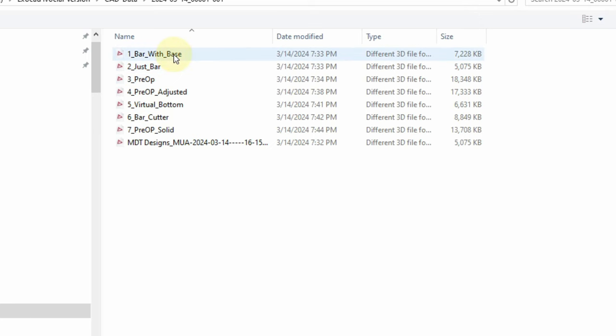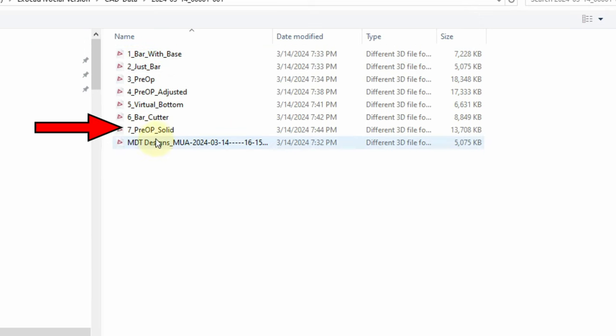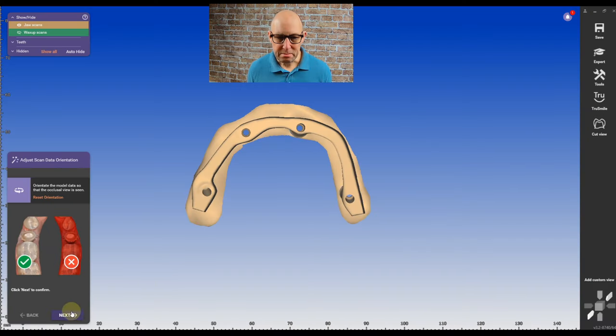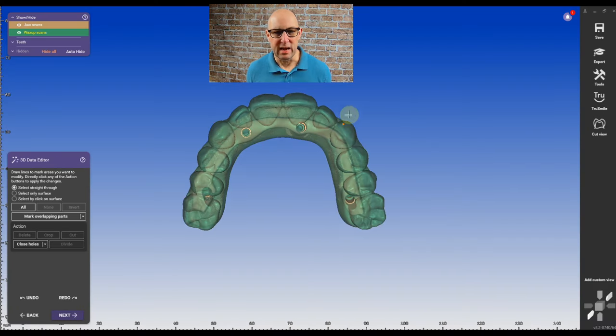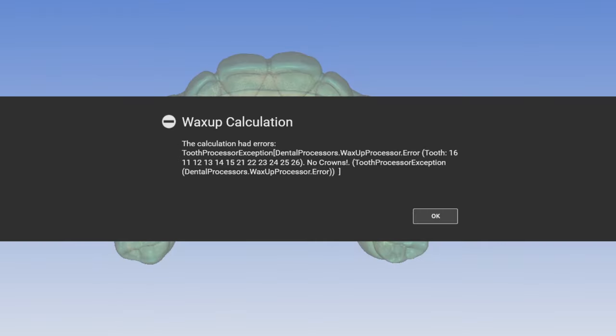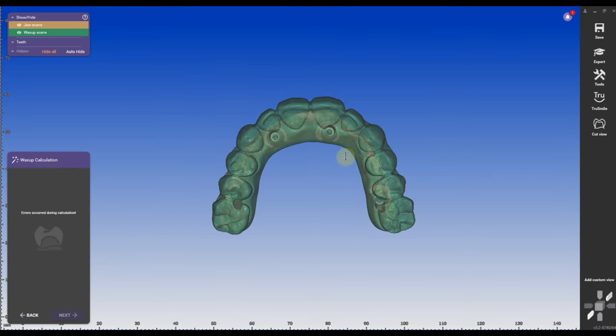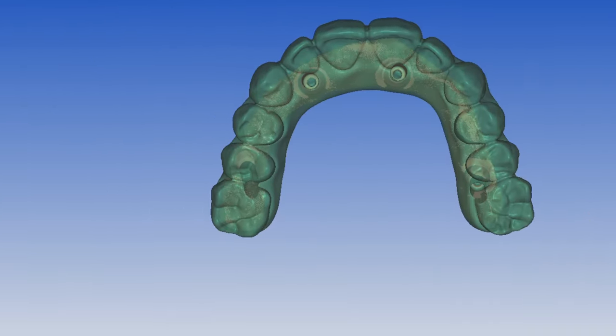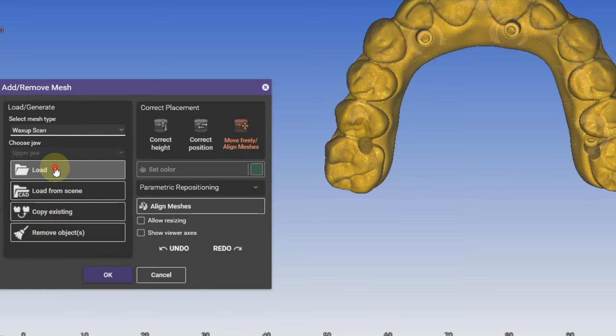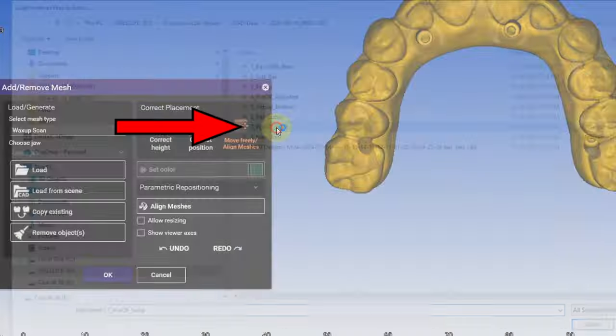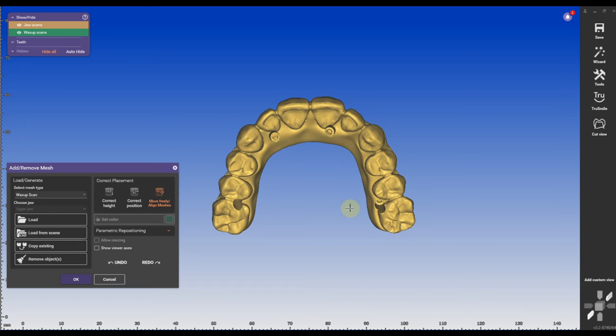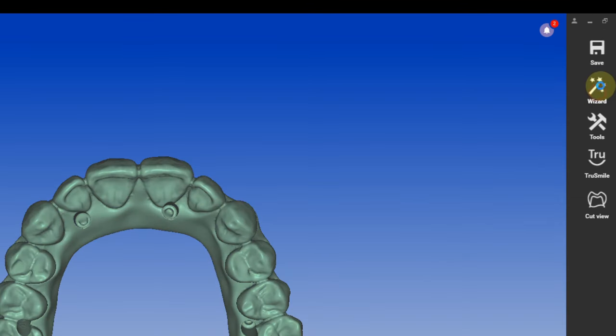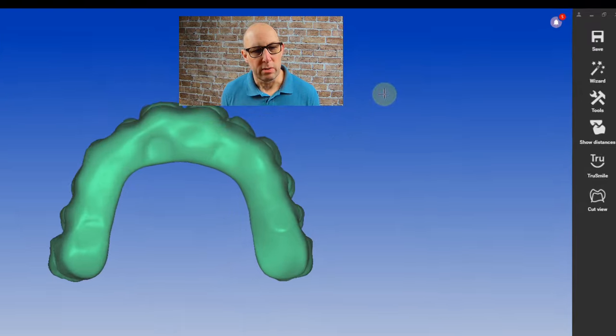I'm going into design, I'm going to import the bar with the mesh and I'm going to import the pre-op solid. Remember the one that I cut out the little multi-unit sites. If you run the workshop calculation here it will fail. Very easy trick, go to expert mode, go to tools, add remove mesh and add just another workshop scan and you're going to import the same scan again. Yes, and Exocad will tell you okay I'm going to move this, I'm going to exchange it. And now the workshop calculation actually works.